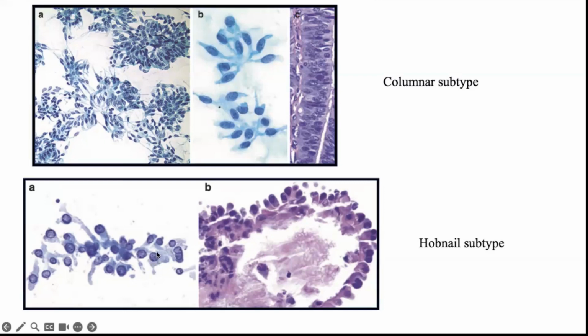Okay. So there is a bulging nucleus. This is what a hobnail actually looks like. It is the large atypical bulging of the cell. The bulging is towards the apical surface, and the cells lose polarity and are very discohesive, and hence this adds to its aggressiveness. They have micropapillary structures and other complex papillary patterns.